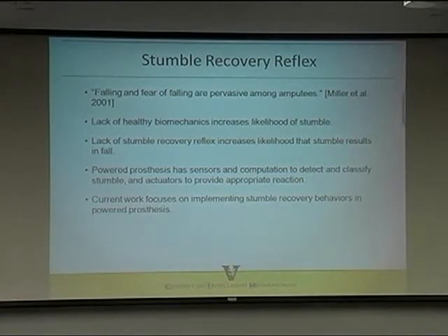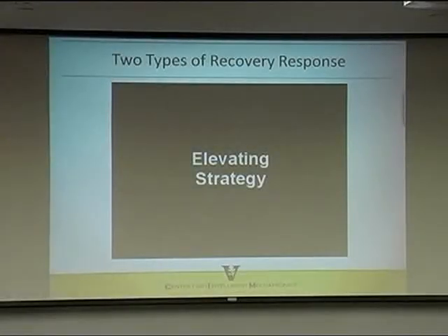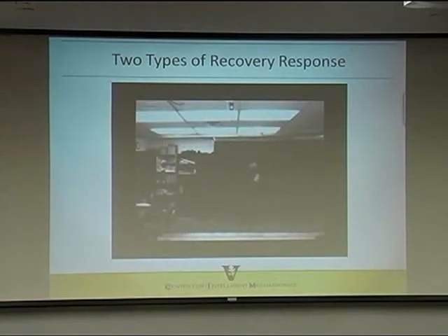So, number one, we hope that by restoring healthy biomechanics, we decrease the likelihood of a stumble. Secondly, if a person does stumble, we are working on implementing recovery reflexes so that we decrease the likelihood of a fall. This is a video. When you stumble, there are two strategies you generally take, an elevating or lowering strategy. The one is picking your leg up over. Oh, this isn't on an amputee. This is on healthy subjects in our lab.